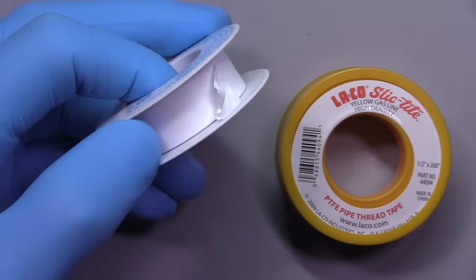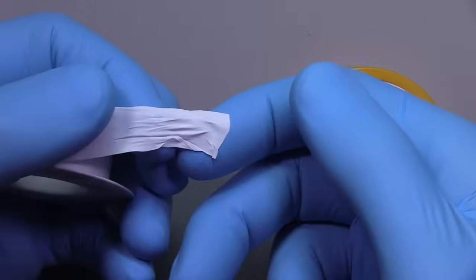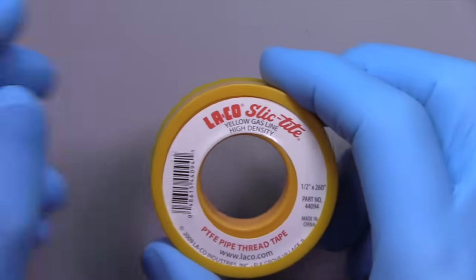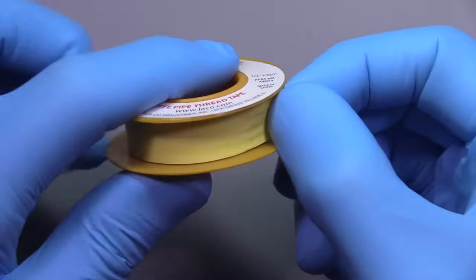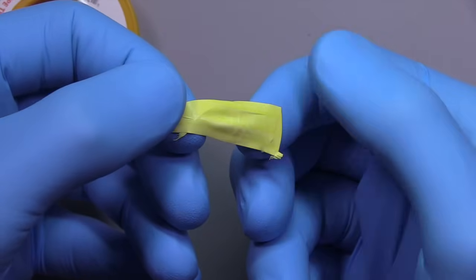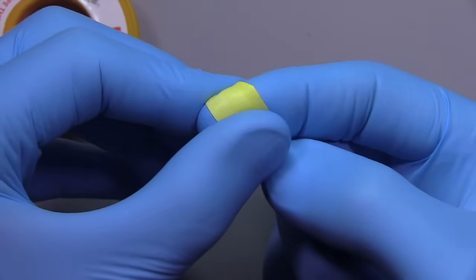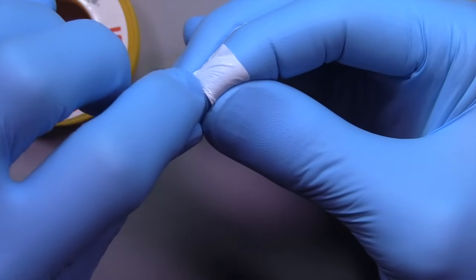These are the PTFE or Teflon tapes we're used to using. The typical thin tape is very thin, but the problem is it crinkles over on itself quite a bit and can stick into your composite. A thicker option is the gas line tape — you can find it in the plumbing section for gas lines. What I really like about this yellow tape compared to the white water-line tape is that you can crinkle it up and it still lays out really flat. It's quite thin, can be stretched, and is less likely to crumple over on itself.